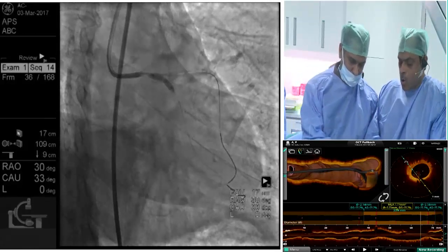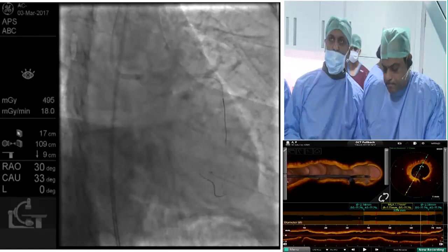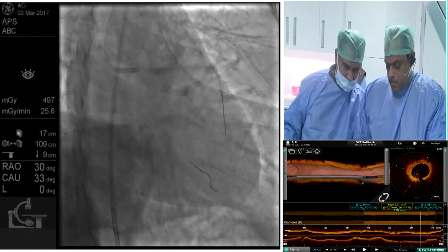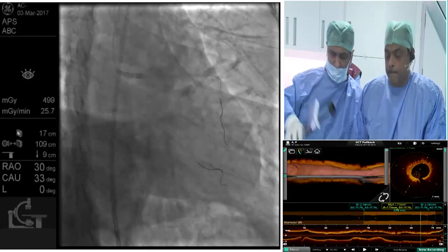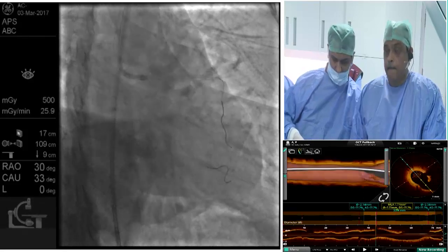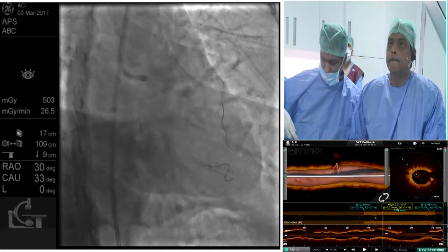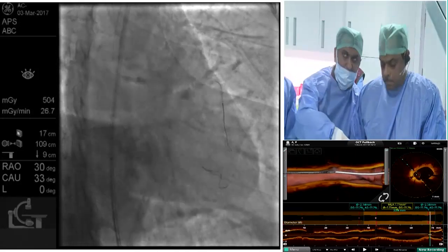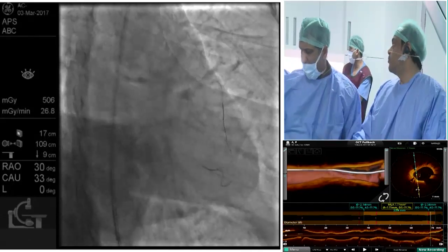Dr. Kumar, what's your choice if you are the operator of this case? I think you already have a stent, and if you put in 2 stents, you have multiple layers of metal. Crossing and recrossing require a lot of good hardware and multiple layers of stent. Would you consider a drug-eluting balloon with 1 stent? Any takers on that? Give another new balloon.